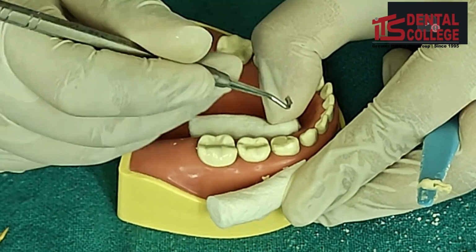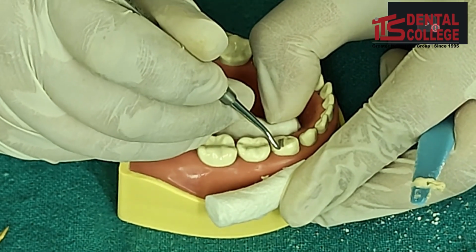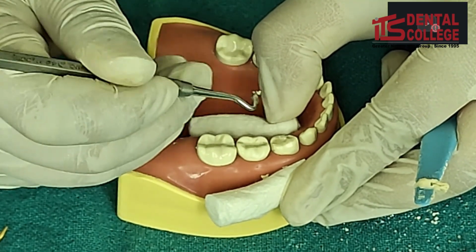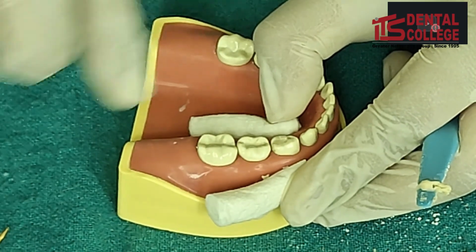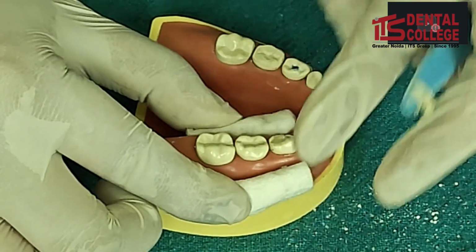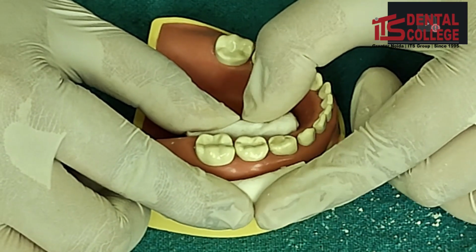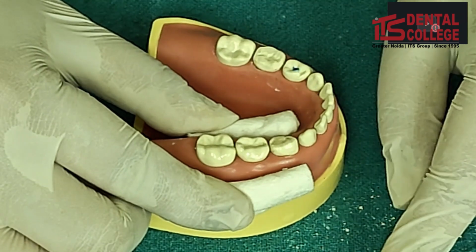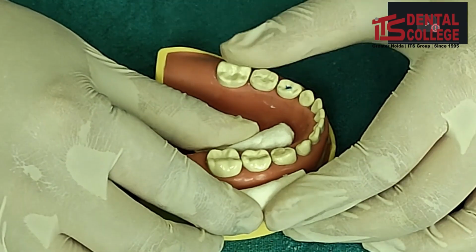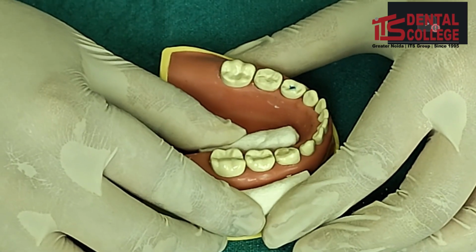A diamond carver may be used to remove any excess filling material. And apply a final coat of Vaseline or white petroleum jelly. You may also use an articulating paper to check for any high points and remove them using a small round burr or a diamond carver. So the initial set of GIC restoration is 7 minutes from the start of mixing and the final set is 24 hours from the start of mixing.